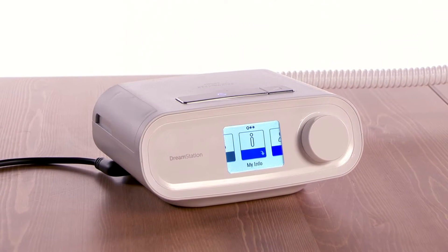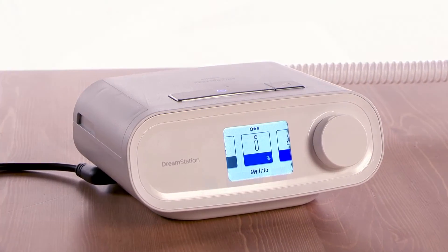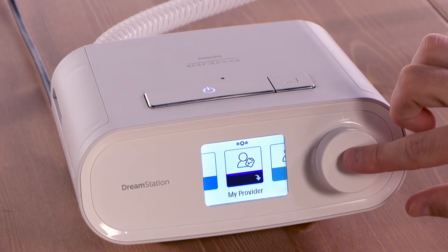Performance Check is a screening tool that can help determine if your therapy device is operating properly. Performance Check can be accessed from a screen in the My Provider menu.